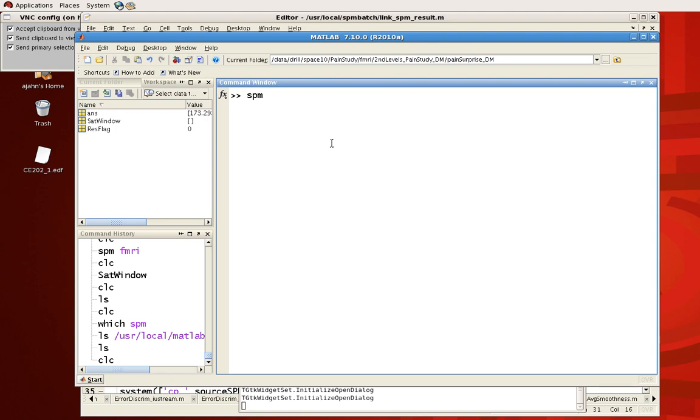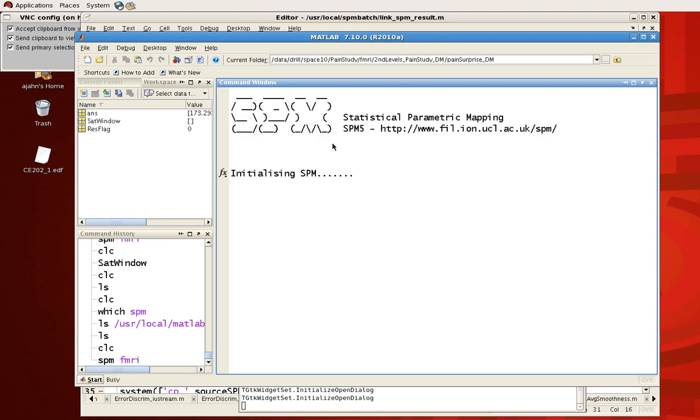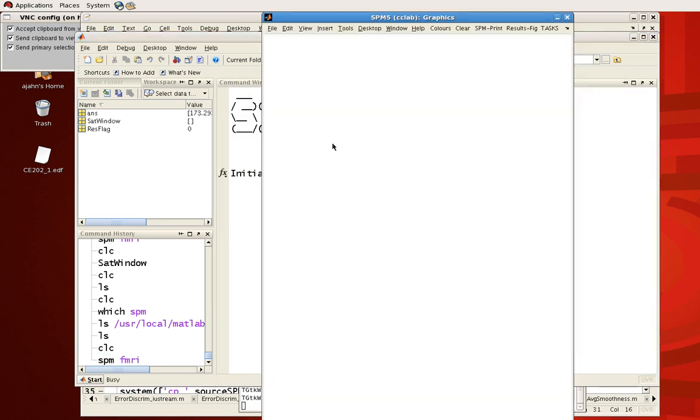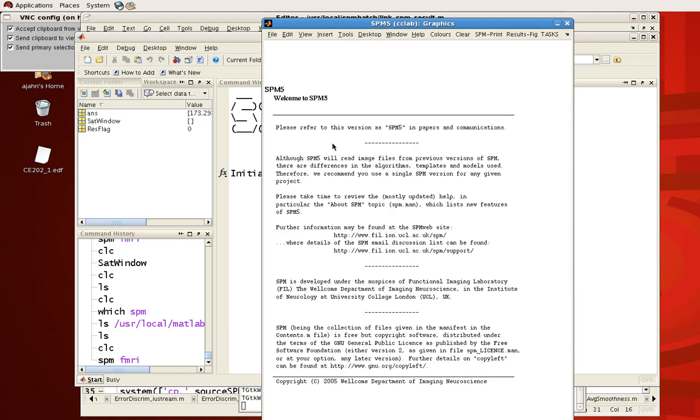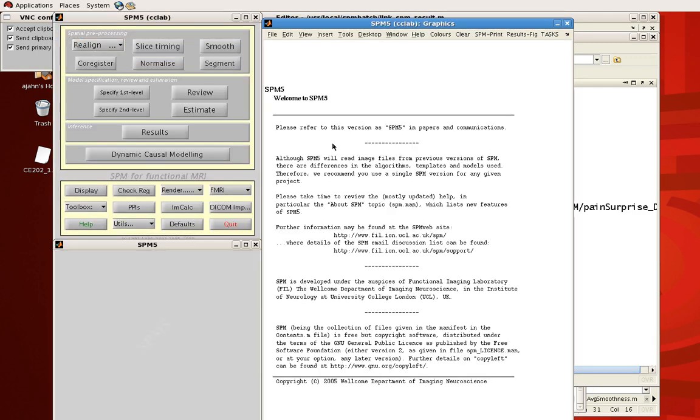Now SPM is a suite which can analyze either fMRI data, EEG data, or PET data if you have that. So what you can do is you type in SPM, a space, and then the name of your image modality. In this case we're going to be talking about fMRI. So you type in SPM, a space, then fMRI, and you should get something like this.